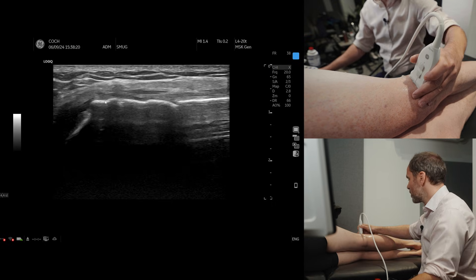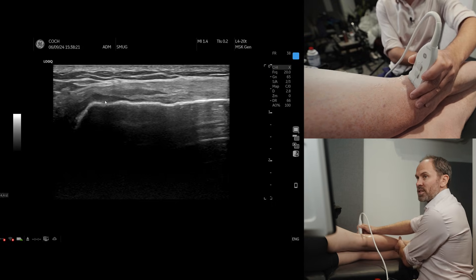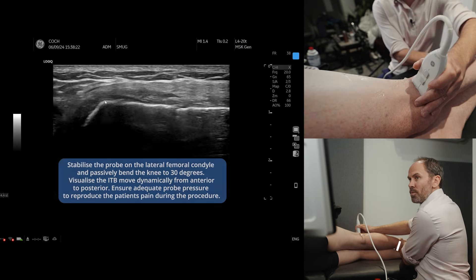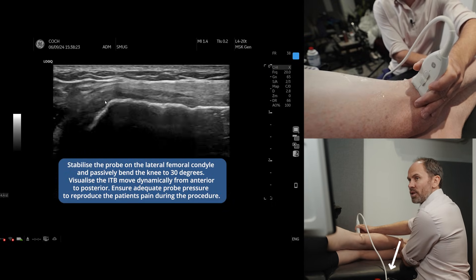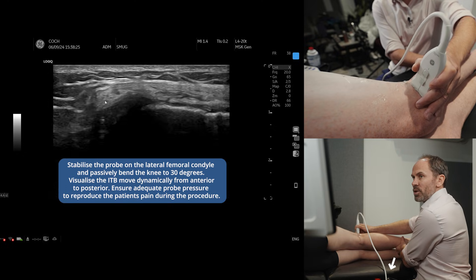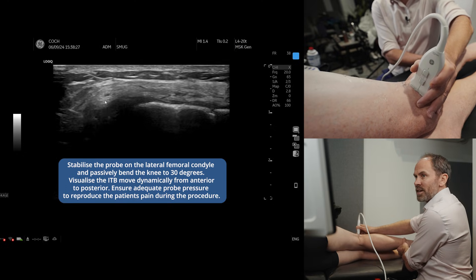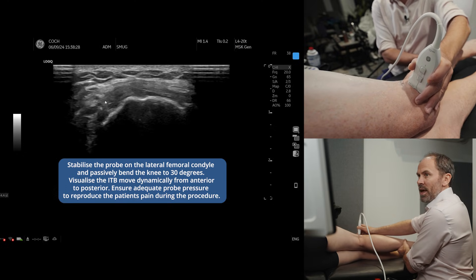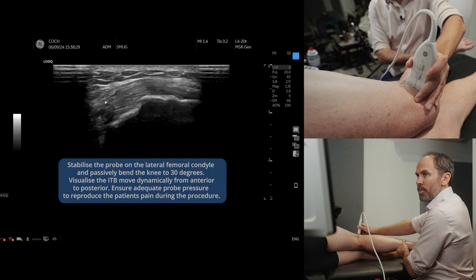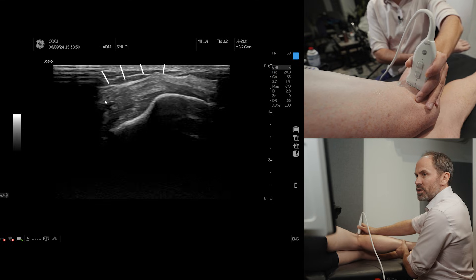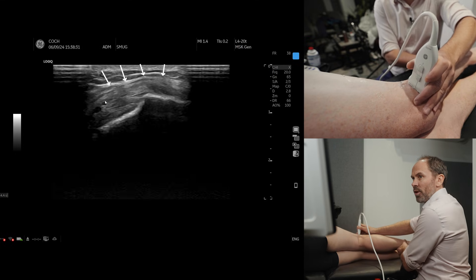Now we can do a dynamic test. If we just move the patient passively, you can see that it goes from anterior and it goes posterior. Can you see that moving across?